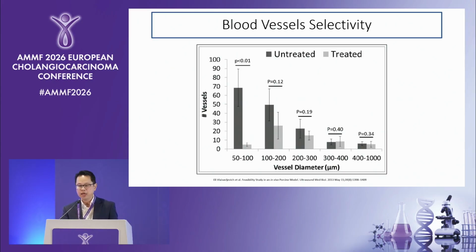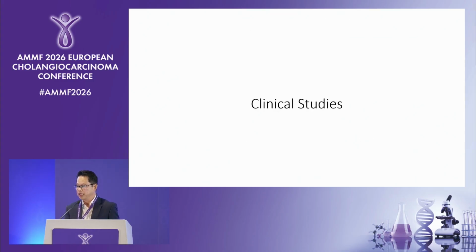But below that, some small vessels will be destroyed. And for that reason, I think most of the time vessels more than 300 microns will be more important than small little tiny vessels.